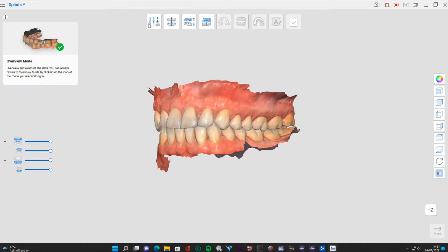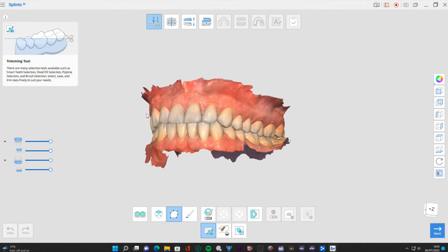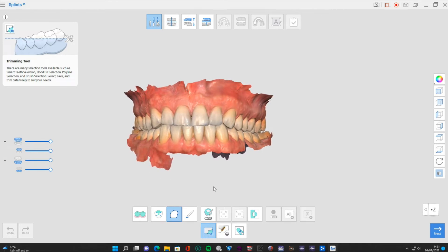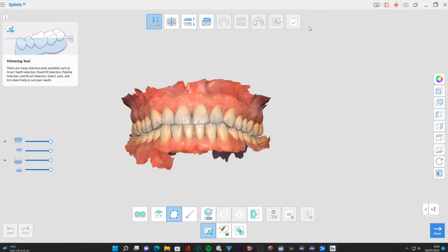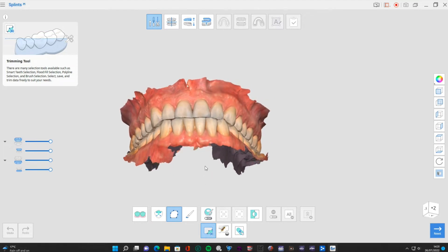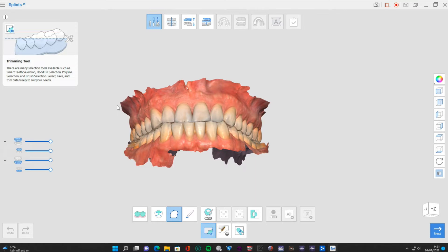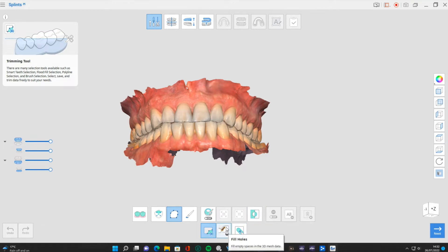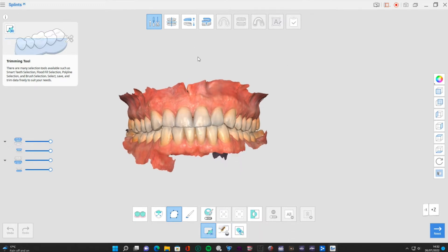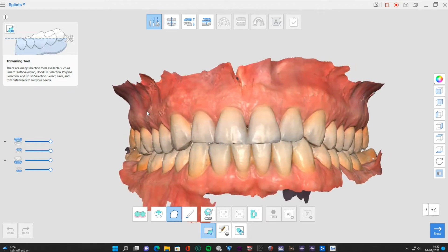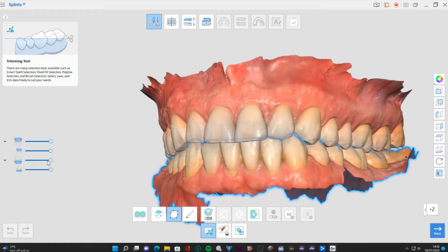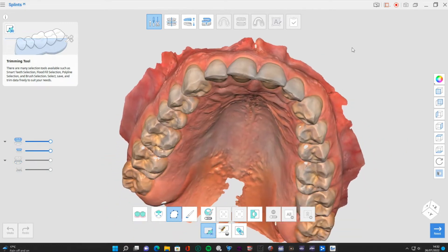Just like the other apps, we have all of these different stages to go through. First we're going to make sure this data is nice - we're going to trim away anything that we don't like. The trimming tool has the exact same layout as some of the other apps: selection tools, reversal tools, paint tools, and hole-fill functions at the bottom. In this case I'm just going to zoom in - I don't really need to delete any of this, though I could tidy it up. Let's turn off the lower arch and check for holes.